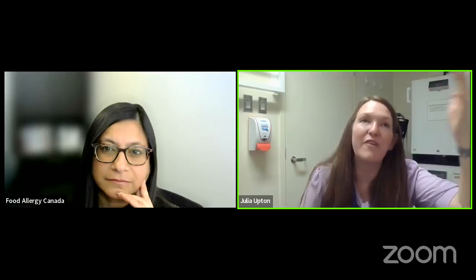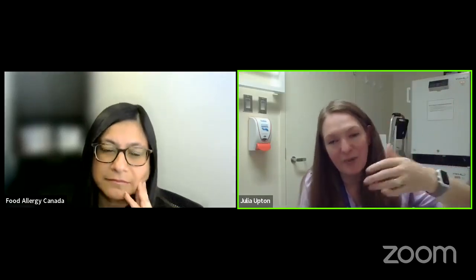So if I'm at a cottage 3 hours away, I might be more apt to use the best treatment that I have than not. Officially you wouldn't have to give it for that. But I always think it's better to give it than not.